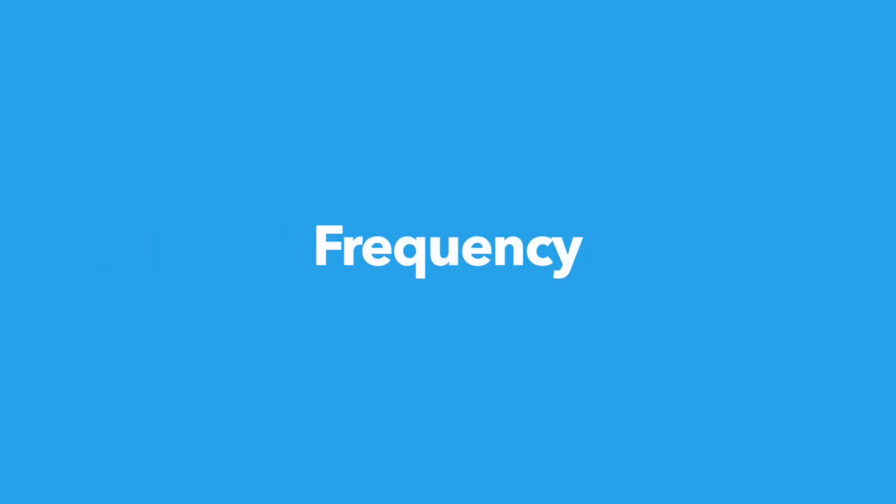Number 3, frequency. Music sounds best with not only a wider dynamic range, but also with a wide frequency response. This means that the hearing aid will reproduce a wide range of low to high-pitched musical tones for better music sound quality. You can check the hearing aid's frequency response in the manufacturer's documentation. Some hearing aids may amplify up to 10,000 Hz.